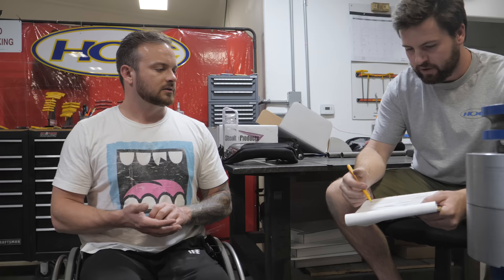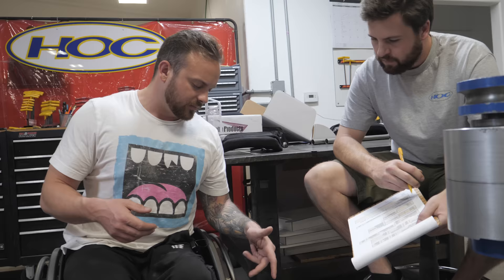For the forks, let's go with black since the rest of the chair is going to have some carbon fiber accessories and other black accessories. But I want my casters silver. Speaking of colors, let me just make one thing clear — your wheelchair is also a fashion choice, meaning it has to match all of your clothes and all of the activities and other things you're doing around town.